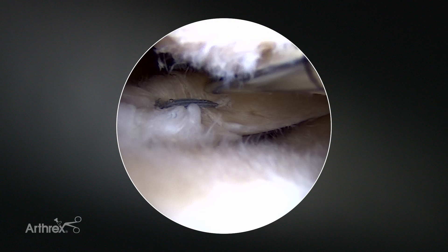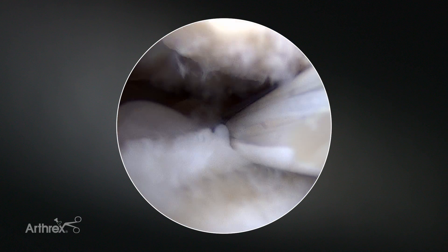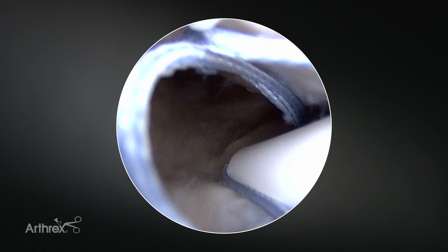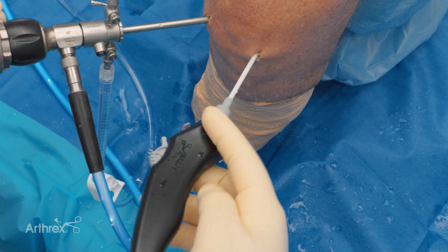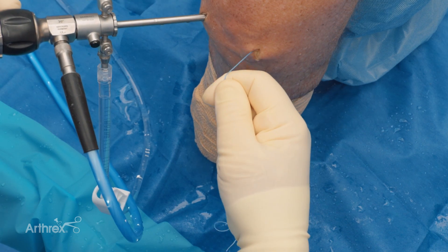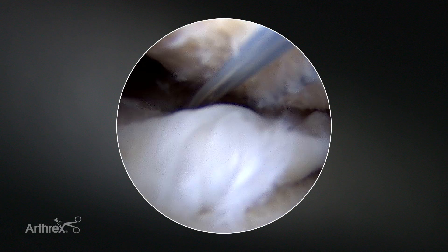I would like to get this up higher. Like on the first one, I'll use my tip to reduce the meniscus in the direction I want — up high. It's just the same mechanism every time, trying not to put any torque on the handle. And we'll just go through the same steps again: set the anchor, then take a probe and get our tightness where we want it.